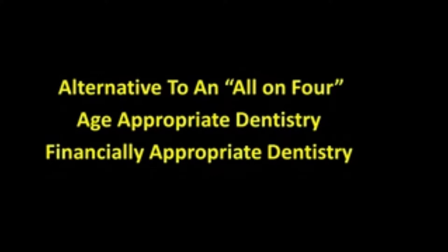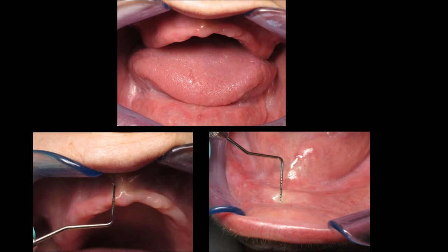It may also be referred to as financially-appropriate dentistry for a patient who is in basically a hopeless situation with minimal finances. Here we see the ridges, and with the periodontal probe you can see that she has seven millimeters of vestibular depth in the maxillary arch and only five millimeters in the mandibular arch. Certainly this is going to be a challenge if we're going to have nicely fitting dentures.